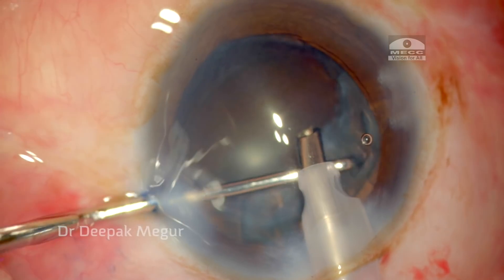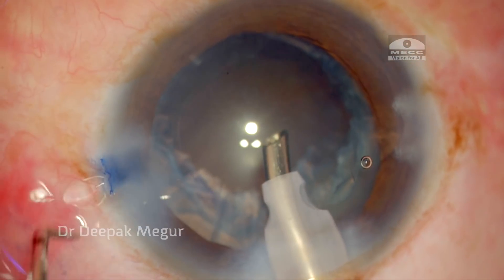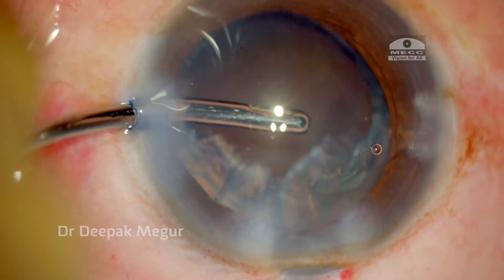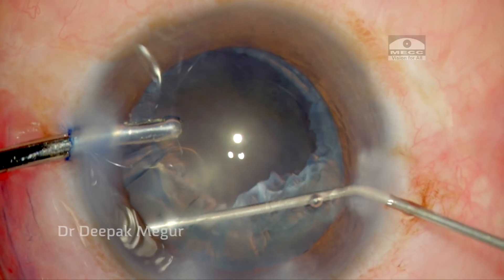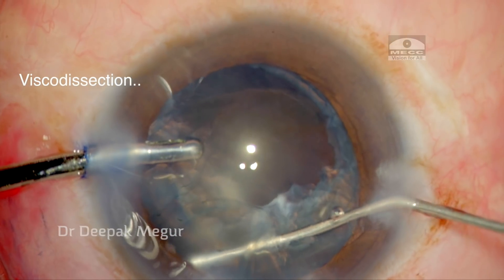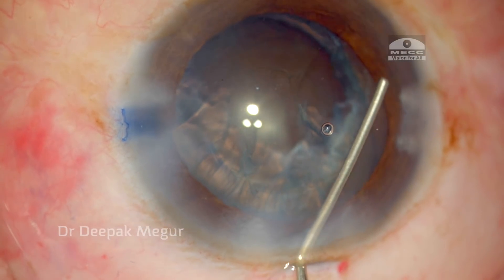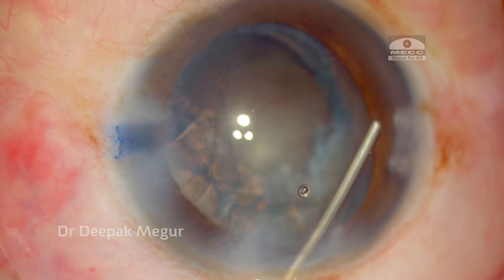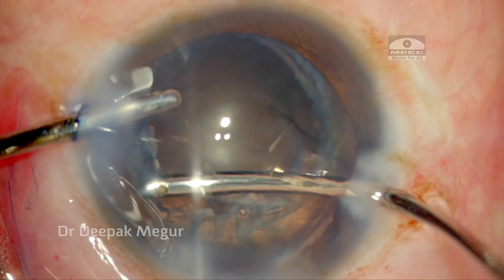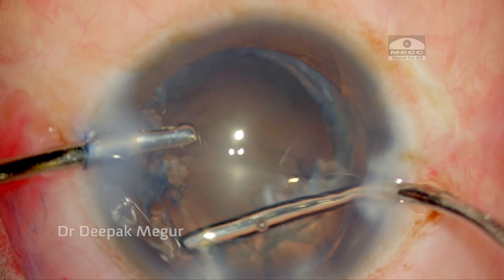The epinuclear shell is quite thick. Before removing my phaco handpiece, I introduce an irrigating cannula so I don't lose the chamber. My plan is to do a viscodissection — I inject viscoelastic under the anterior capsule, hoping to maneuver the epinucleus out of the fornices of the capsular bag. However, the epinucleus is quite thick and it's refusing to engage into the bimanual cannula, so the first plan didn't work well.